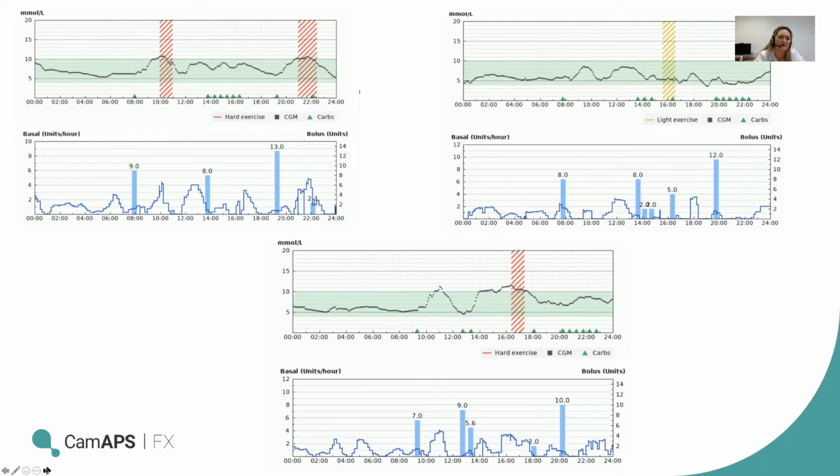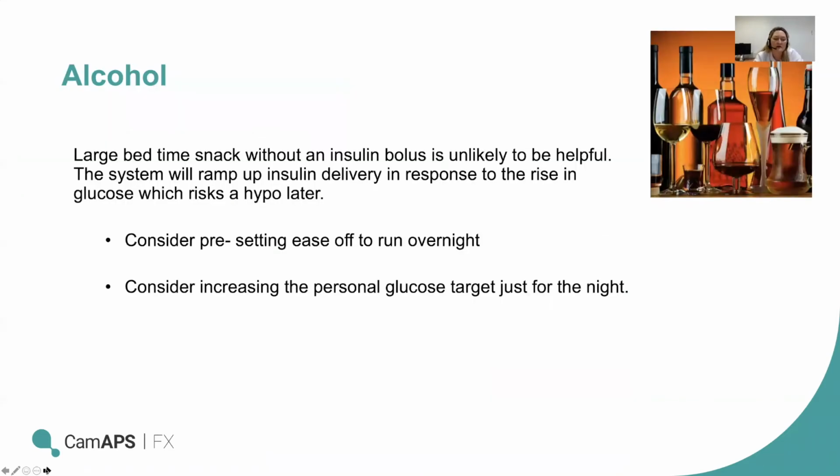If we go to the next slide, thanks, Candice. So just having a little think about alcohol. There are just a couple of key differences when you manage alcohol on closed loop systems compared to if you'd been on normal pump therapy.